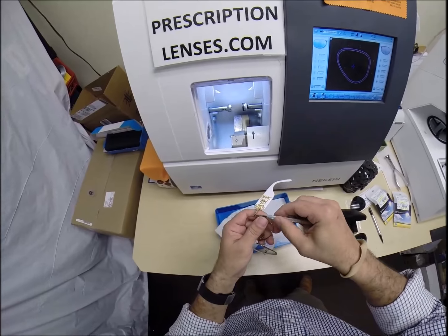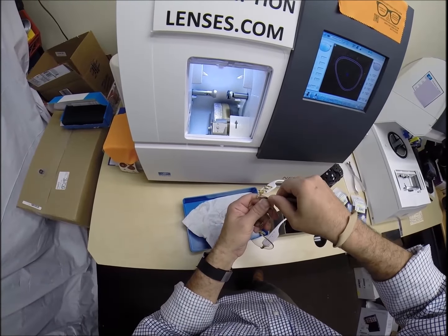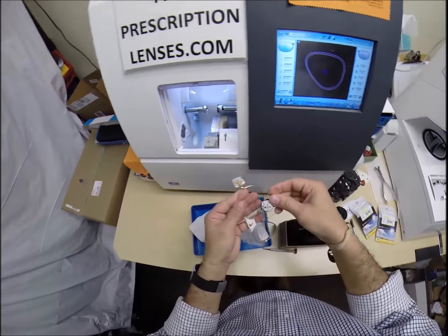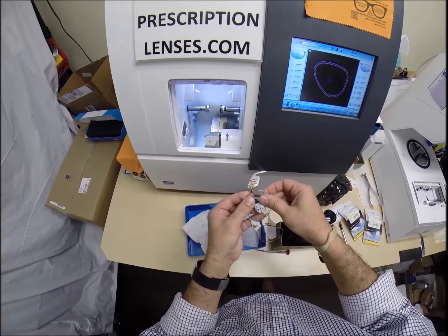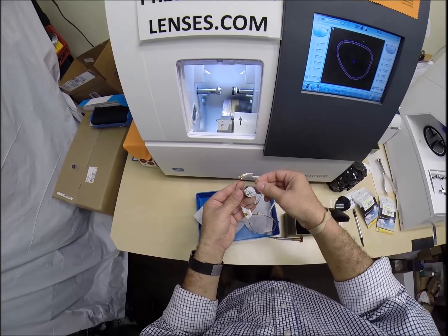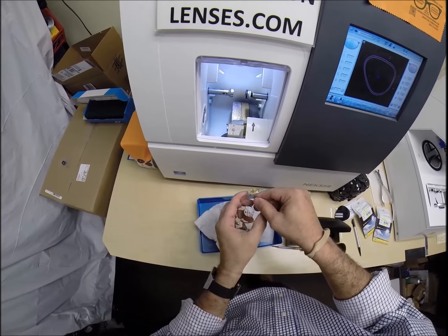A little bit of lefty-loosey, remembering to keep the frame upside down. Loosen it just enough, but don't let the screw come all the way out. Tuck it in at the outside corner. Go around gently and press into the frame. The screw came all the way out, but I was ready for you. It did not pop out.